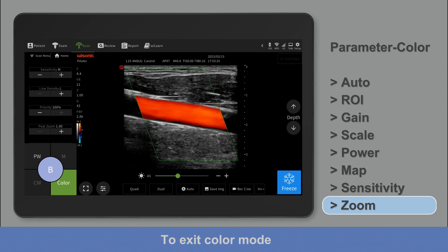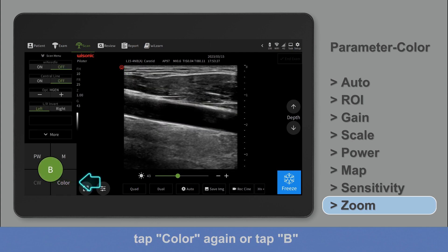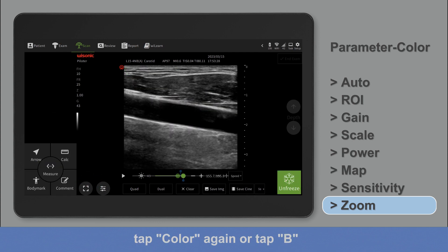To exit color mode, tap color again or tap B.